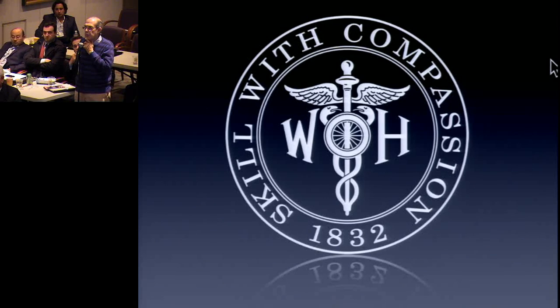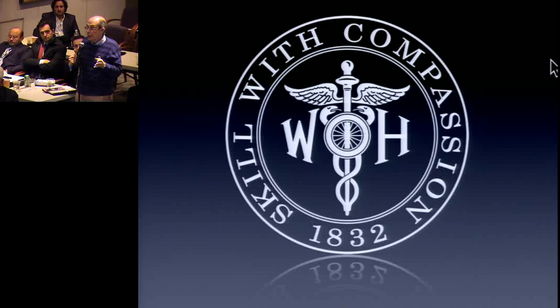How do you know? I must admit that, for example, in the HRT, which I use, it's highly dependable on the operator, and many differences found between examinations are mostly differences in how the images were taken, and the baseline differs, and you cannot really compare. But one other thing that I may say is that using HRT and OCT allows to know exactly the size of the optic nerve disc, which is highly dependable otherwise and subjectively.